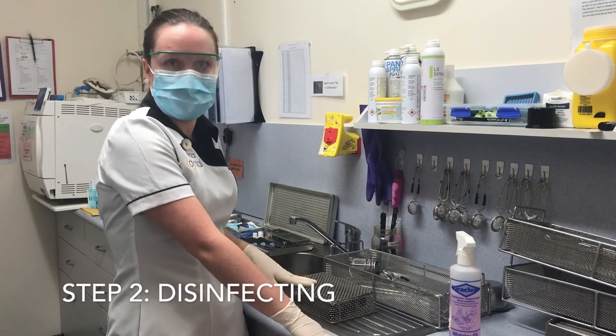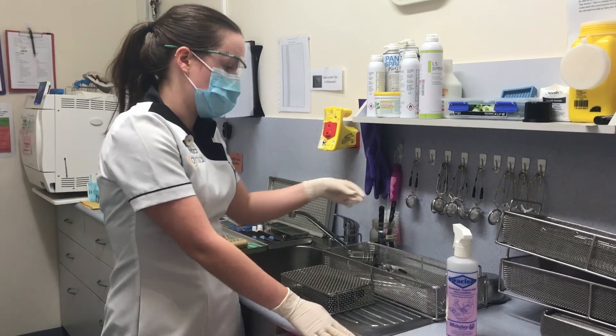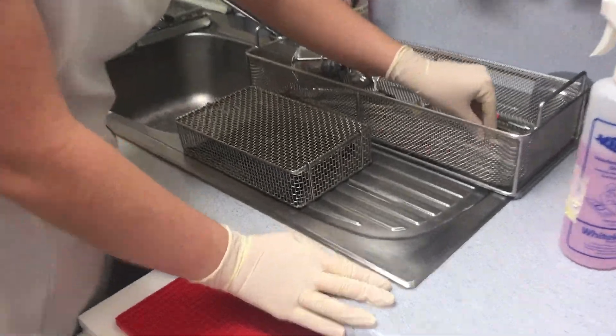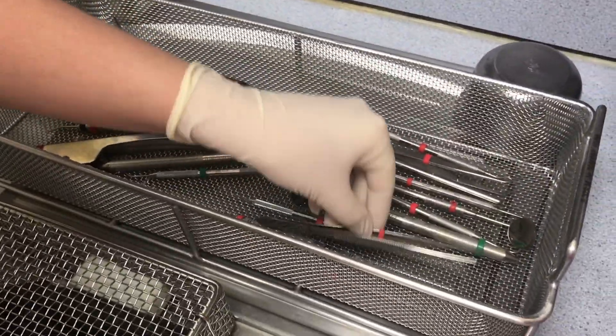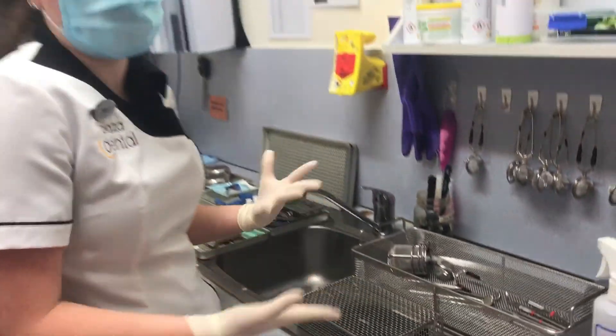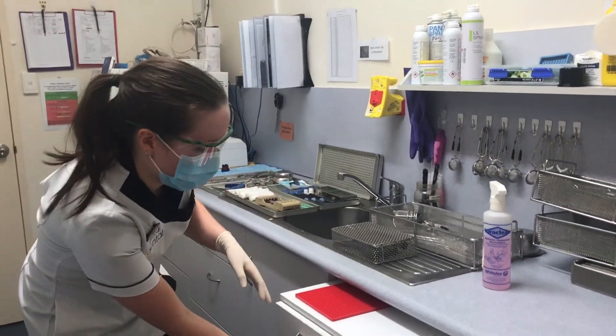Once we've removed our instruments from the trays, they're ready for processing through the thermal disinfectant. Just make sure that the instruments are not too close together — you do want a little bit of separation between them so they are able to be properly cleaned in the dishwasher.